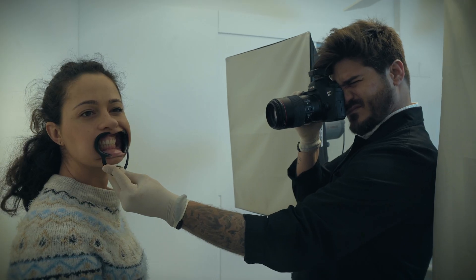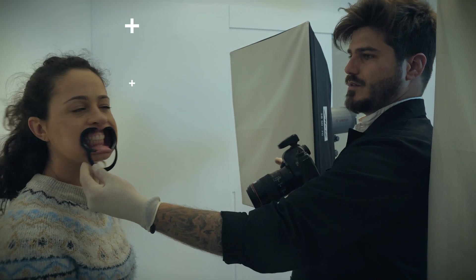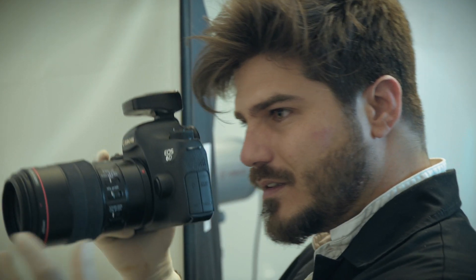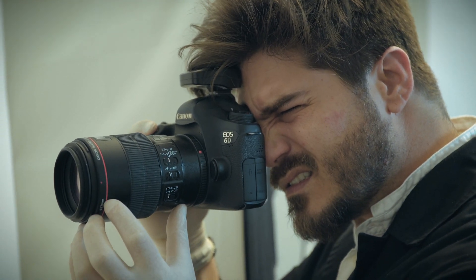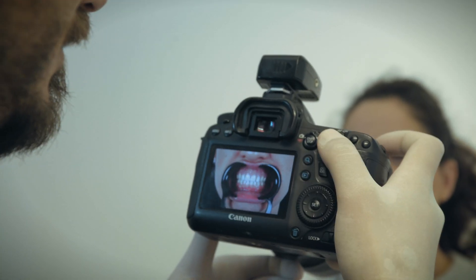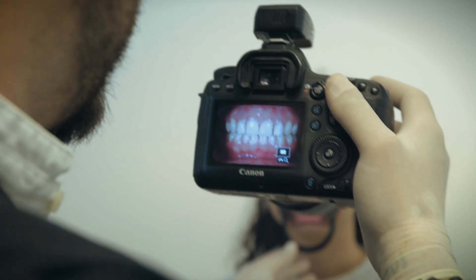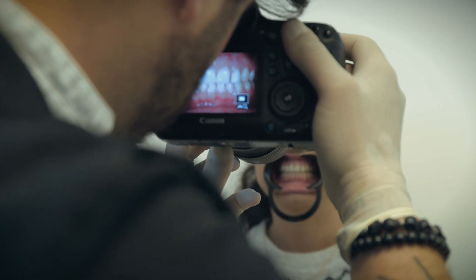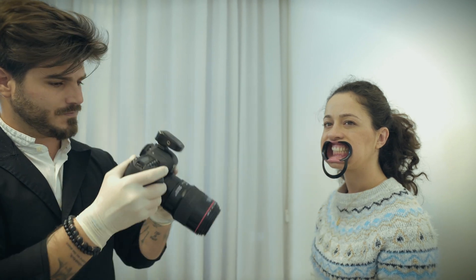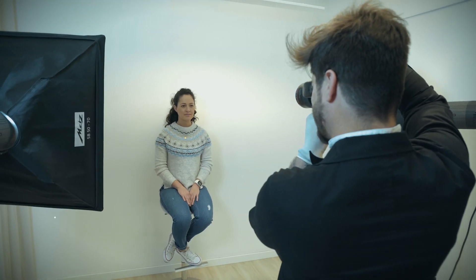Despite the importance of photos, the beauty of a smile and the dynamic integration of teeth, gingiva, lips, and face are also a result from motion. Therefore, a video protocol should also be necessary. With all data collected, we start designing the smile that we and the patient intend.